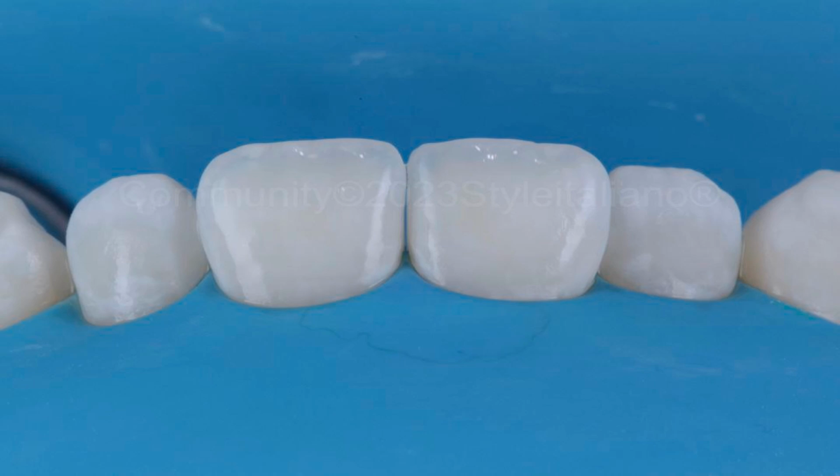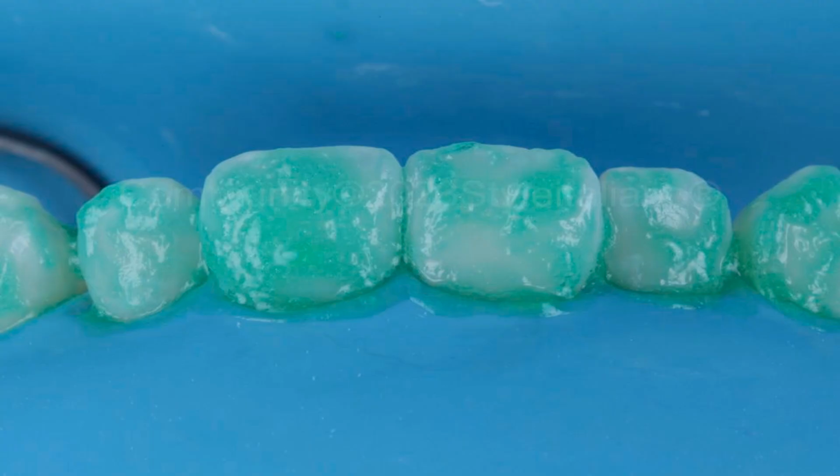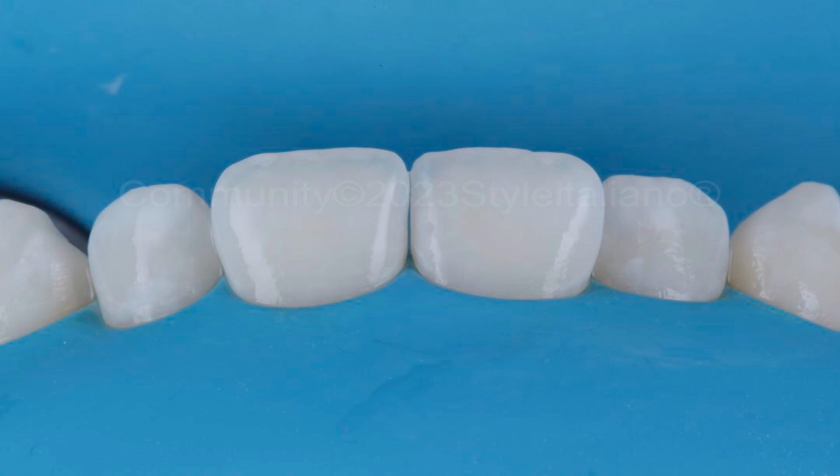Appearance of the teeth with ICON Dry in place shows some masking of the white spots, but not completely. We do a second 2 minute cycle of etching, this time covering the entire labial surface, as the ethanol stage shows cervical white patches. Cycle completed and test drive with ICON Dry, which is 99% ethanol.